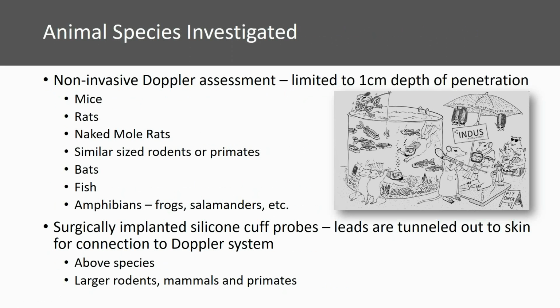When using the non-invasive probes, we have had success scruffing the animals. This is of course best done on a trained animal to avoid any increase in the heart rate or blood velocity that may be caused by stress. Likewise, if an anesthesia is used, the choice of which one to use is equally important, so as to not decrease the heart rate or blood velocity. As you will see in a few slides, we also include a heated platform to help maintain the body temperature of the animal during the acquisition. As well, this platform helps us to monitor the ECG signal along with the heart and respiration rates.